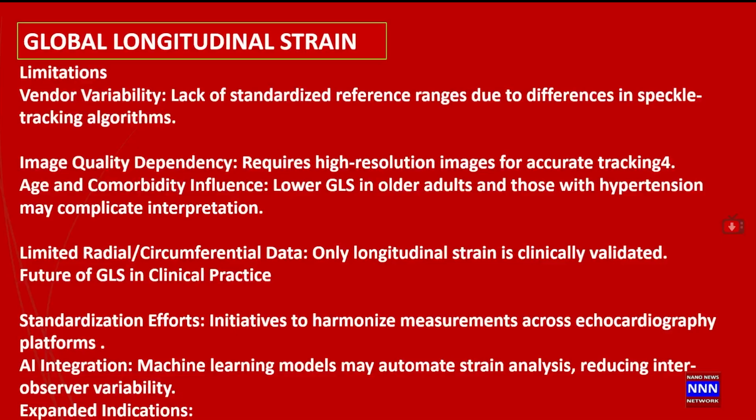Whereas with echo, it may sometimes be difficult, even though we can use Simpson's method to get a fairly accurate ejection fraction based upon the radial shortening. The biggest challenge is tracking these speckles in patients who are having these global longitudinal studies. The speckles are tracked using different algorithms by different machines, so you can't compare studies from one machine to the other. Number two, the technique also makes a significant difference as to how these images are being tracked.